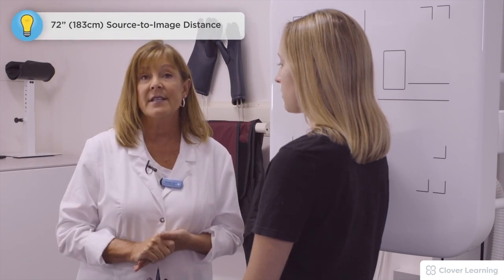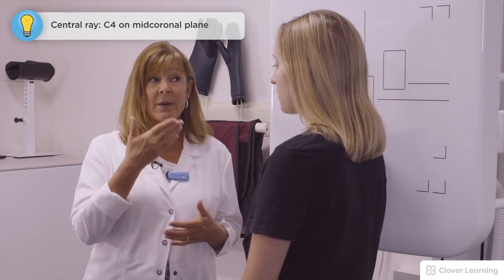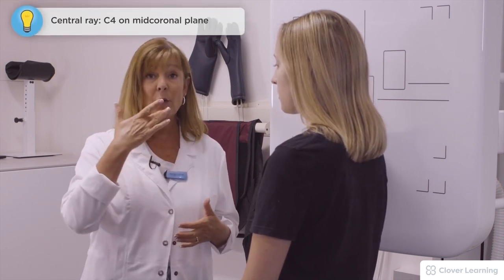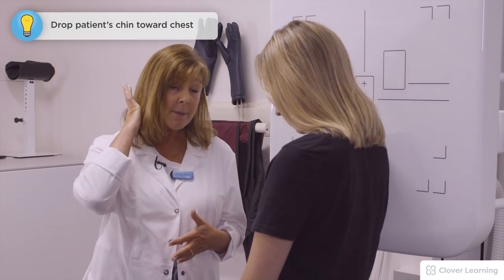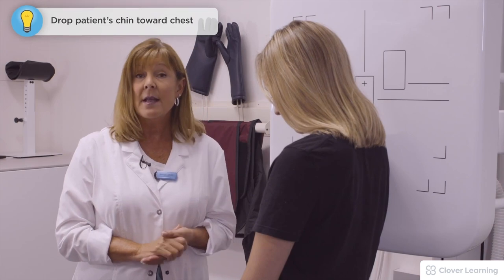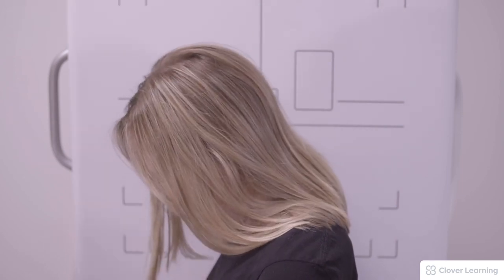For flexion and extension of the cervical spine, our patient is at the upright Bucky, the tube is set at 72-inch SID and is perpendicular, and we are centered at C4. For flexion, I'm going to have the patient bring her chin down towards her chest — this opens up the spinous processes and the spaces in the back. Flexion and extension is to show mobility and movement of the cervical spine.